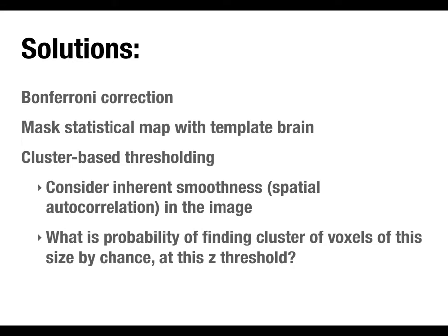So you do have to be, even as a consumer of brain imaging papers, you have to attend to what they did in terms of their statistical thresholding and think about whether that actually makes sense and what the downsides or limitations of that set of choices might be. Oh yeah, and there's one called false discovery rate, which is another variant of the cluster-based approach.